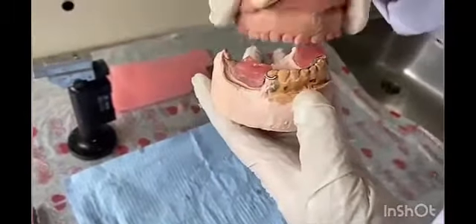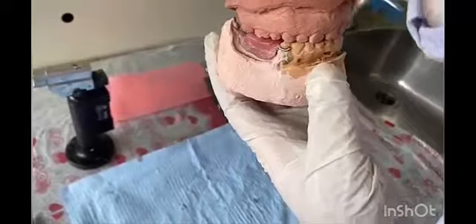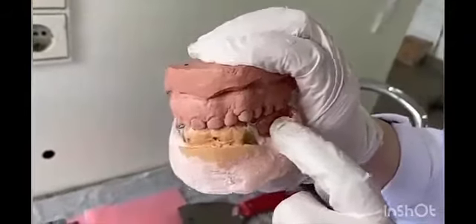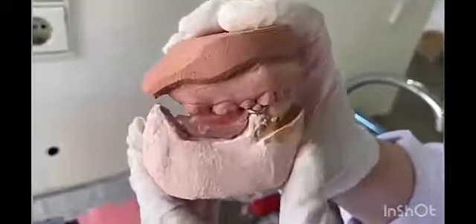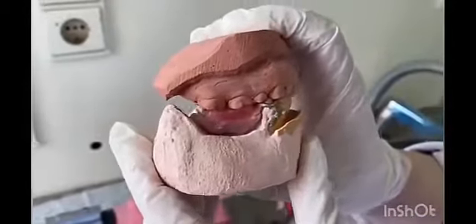بعد ما حطيت الwax layer الجديدة وعملت re-softening وحطيته تاني في بق الpatient، ظهر عندي الocclusal relation زي ما إحنا شايفين. هجيب الupper cast وحطه على الlower cast وأتأكد إن الocclusal relation على الcasts هي نفس الrelation inside patient's mouth. الupper molars عاملين imprint في الlower wax في الtwo sites. كده الcasts جاهزين يروحوا للtechnician علشان يعمل arrangement of teeth ويبقوا جاهزين للnext step إن شاء الله، وهي try-in. Thank you for listening.